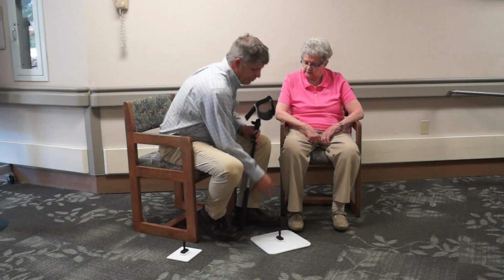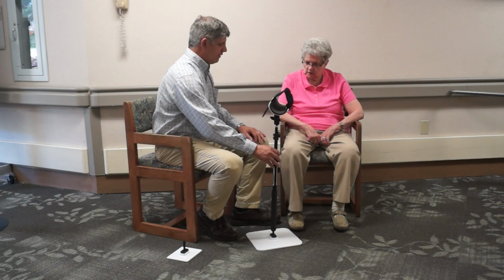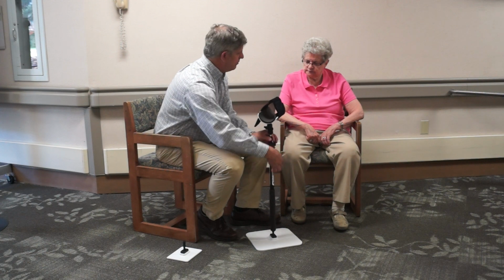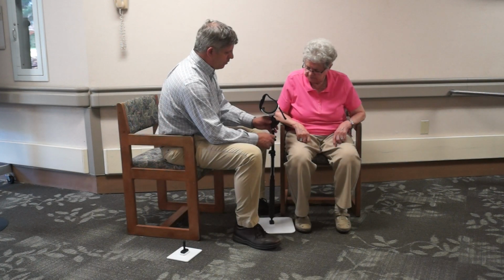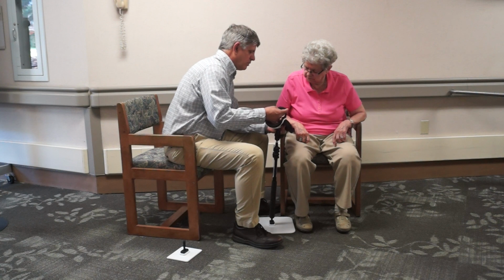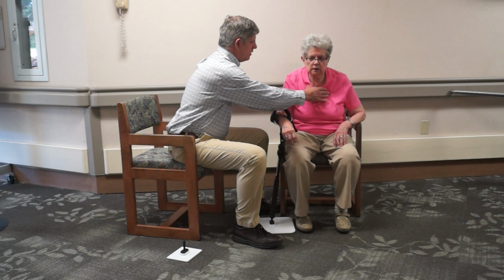So we'll put that on the ground, we'll put this tool over the top of that, and then that holds that for you, okay? So I'm going to bring this down, and we're going to put your right arm in here. Now, if you want to scoot forward just a hair, I'll do the work, I'm going to bring this to you. So we just slide your right arm in there, and just rest. I'm going to have you sit just a hair taller.